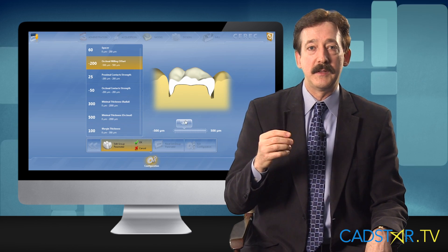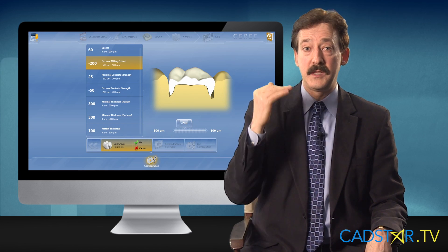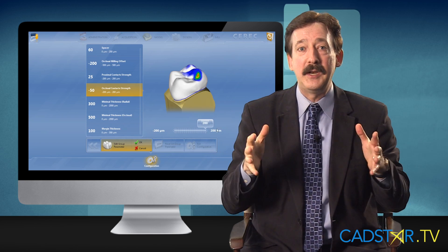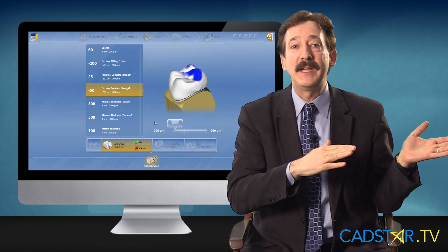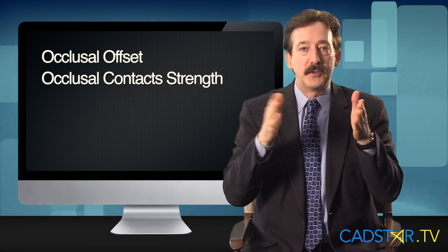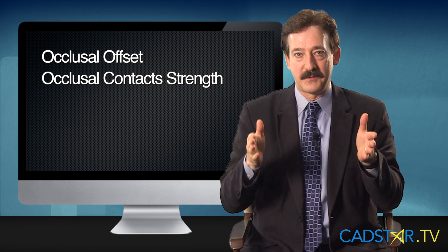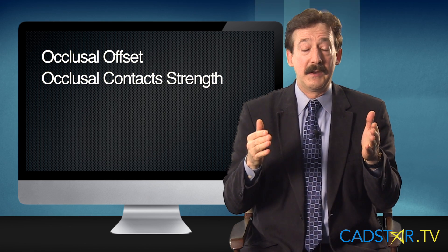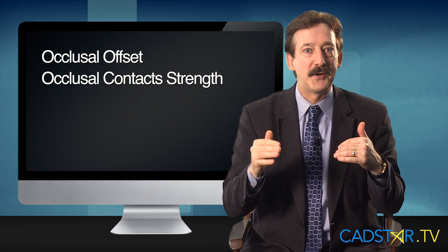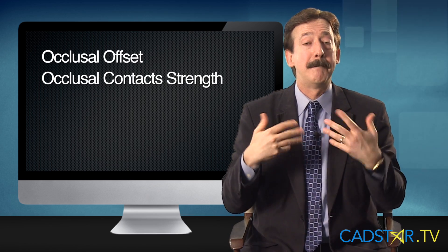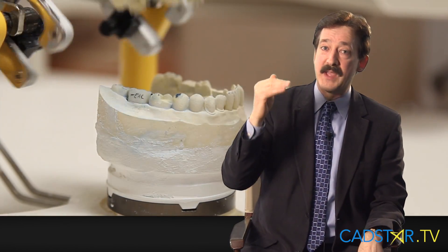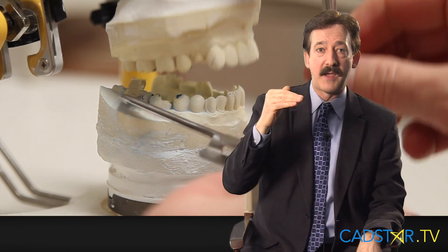There are two parameters that significantly impact the occlusion — and that's assuming that our restorations are seating all the way, so that's in the spacer section. Those two parameters are occlusal offset and occlusal contact strength. If we're using biocopy, which is what we used to call correlation in version 3.85, the primary factor that affects occlusion is occlusal offset.